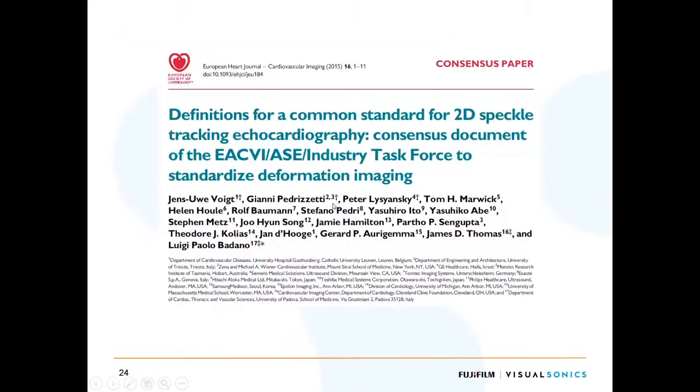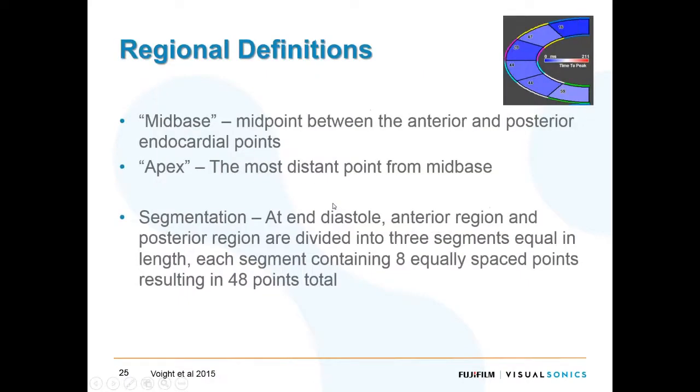Here's where I want to get into some common definitions for echocardiography. When I refer to a mid-base in the heart, especially on the segmental synchronicity page, what we mean is the midpoint between the endocardial points of the anterior and posterior wall. On this cartoon on the top, it would really be right here at the middle red line.